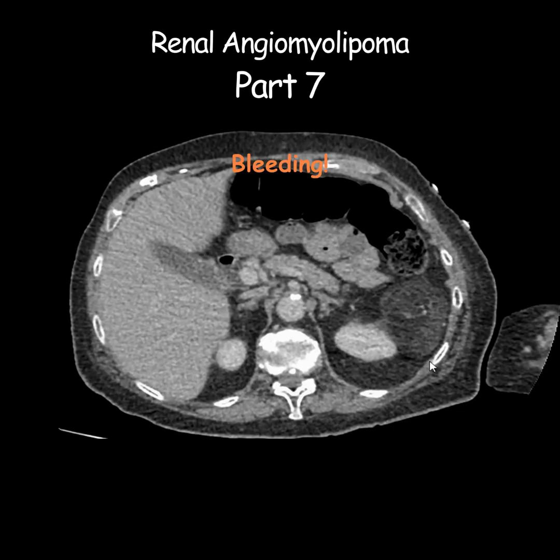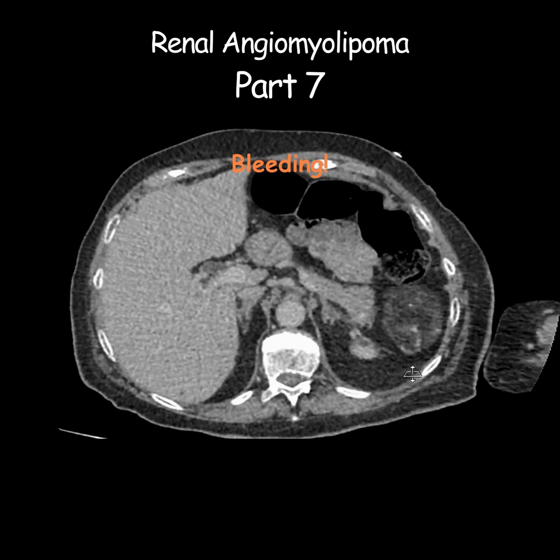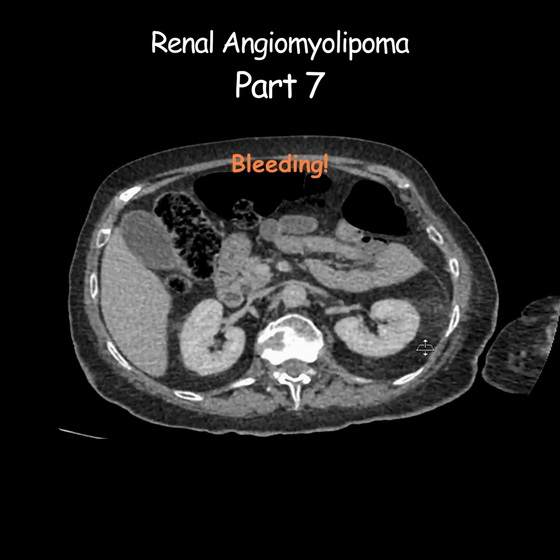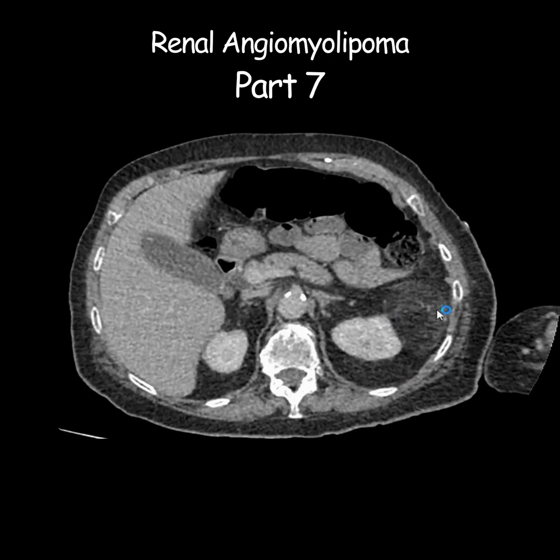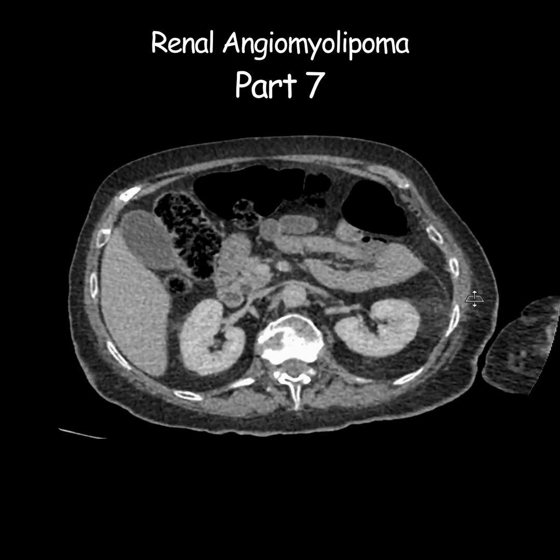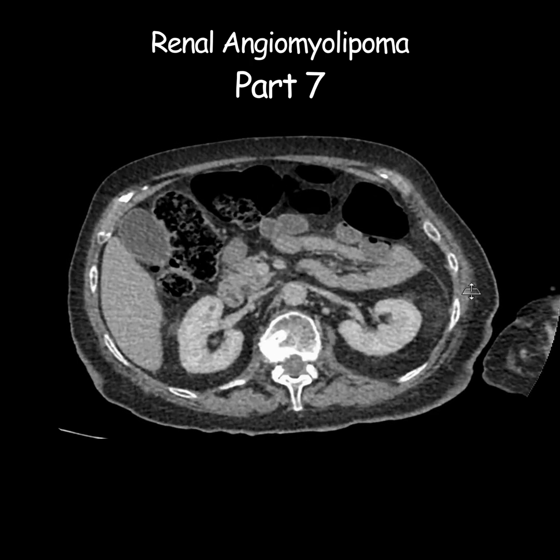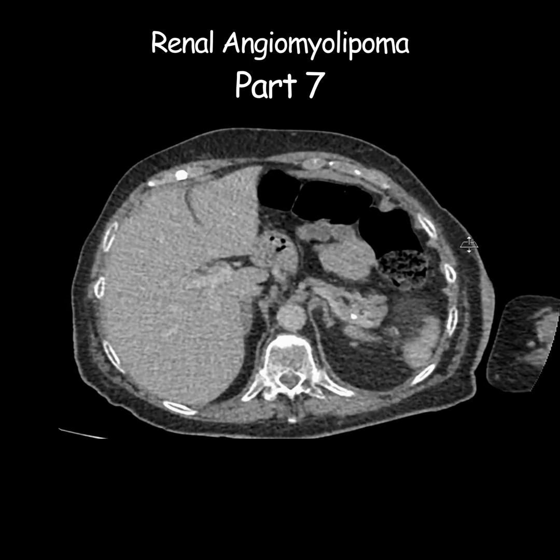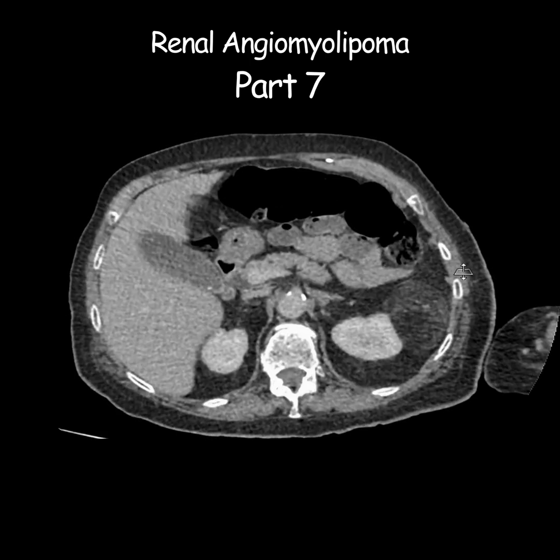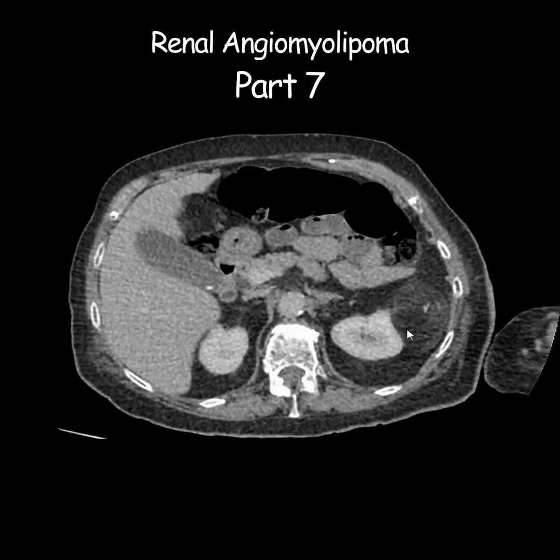And how do you think bleeding would manifest on imaging? And has it actually bled on this imaging? Well, the lesion appears — like I said, it's a bit denser than the other fat, but still homogenous enough for me. I think it does not have that fluid component in it to suggest that it has bled. At least there is no recent bleeding.